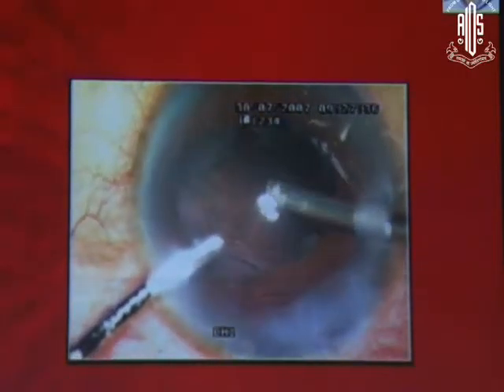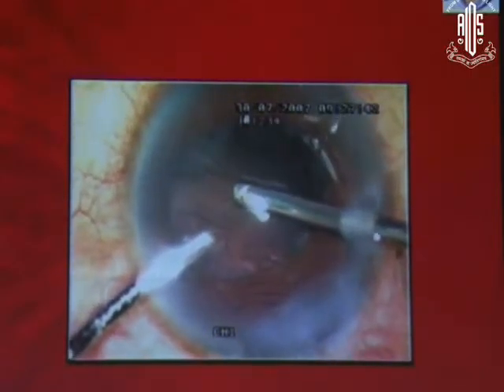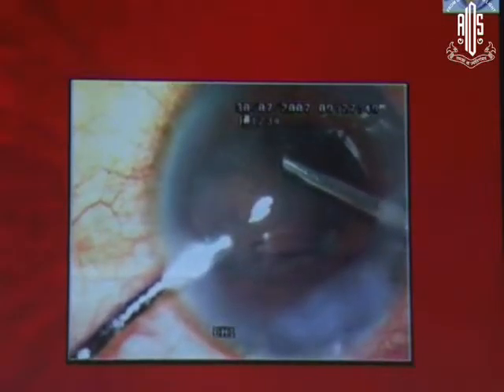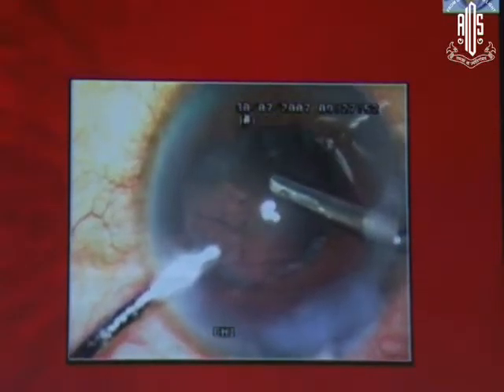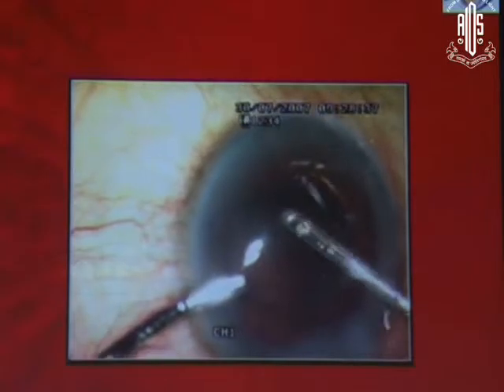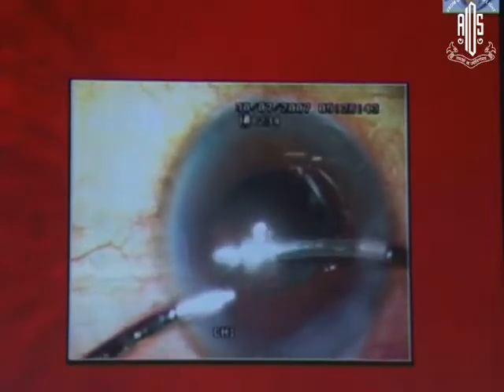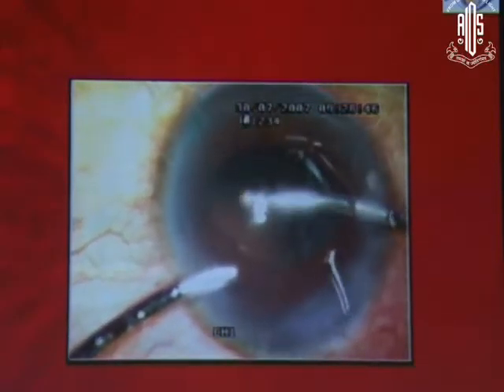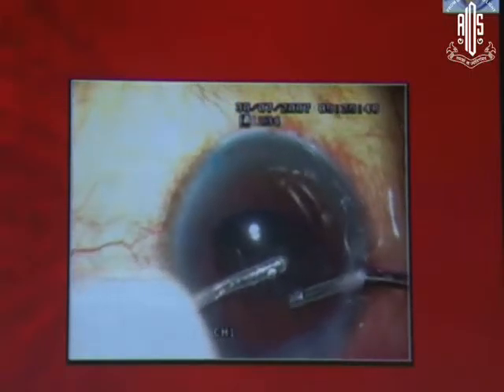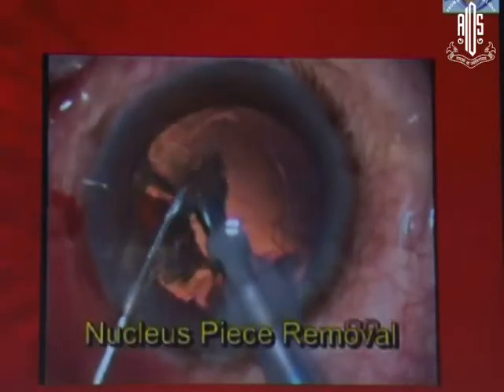At that time in 2007, we didn't have the advantage of preservative-free triamcinolone, but we just did a bimanual vitrectomy. Clear the vitreous first using a high cutting rate — clear the vitreous first in the pupillary area — and then do a bimanual IA to remove the cortex as well. You can see the anterior chamber maintainer here; you keep changing the instruments on your right side only. Either the cutter or the bimanual IA aspirator for aspiration — remove the cortex — and then go ahead and put the lens in the sulcus. Not a single-piece lens — use a multi-piece lens in the sulcus.